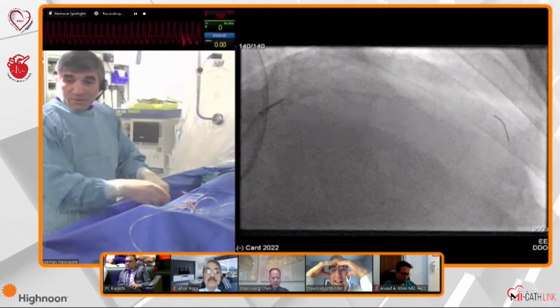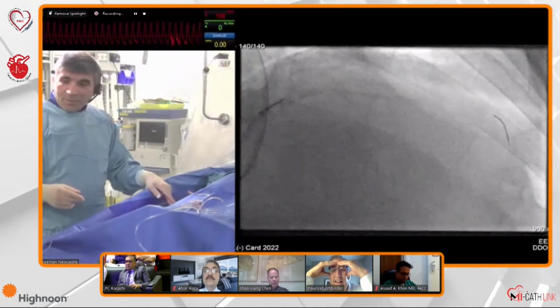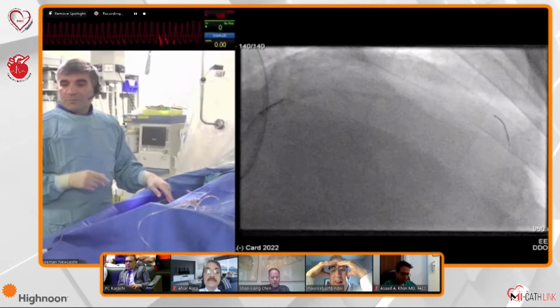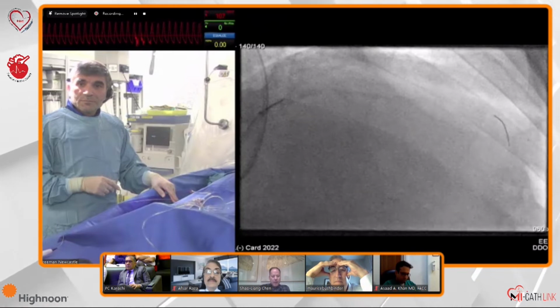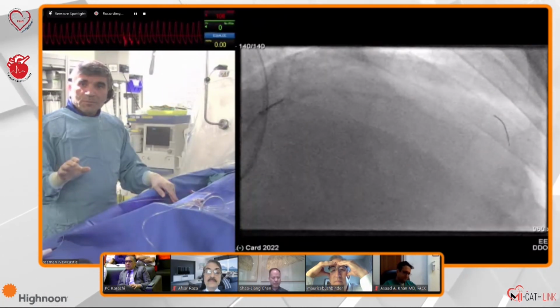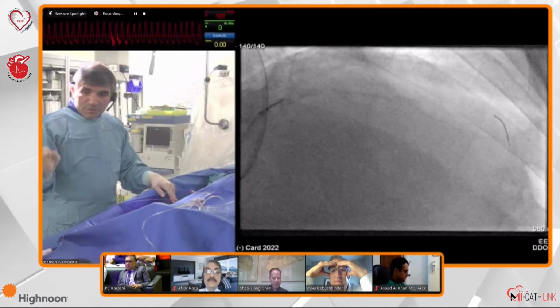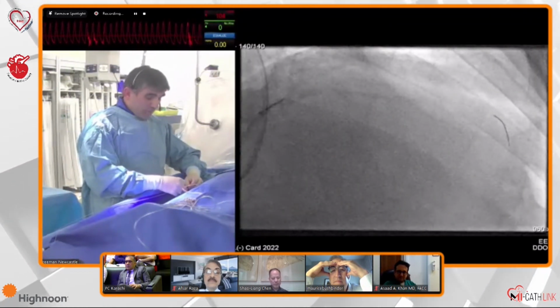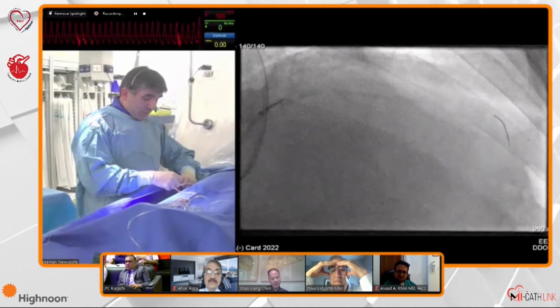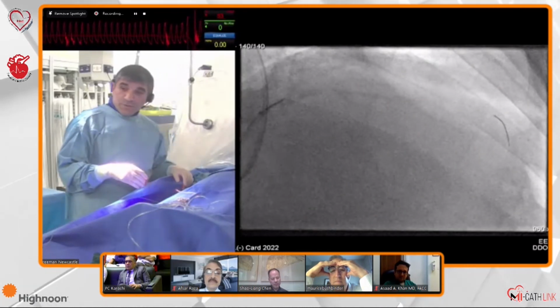Right, so we're going to take the Dynaglide off. Okay, 155 gone. Do you remove the circumflex wire? Yes, I have. Okay, stop there. I don't know how people do it, but if I could show you, I usually don't screen when I'm putting my burr in.